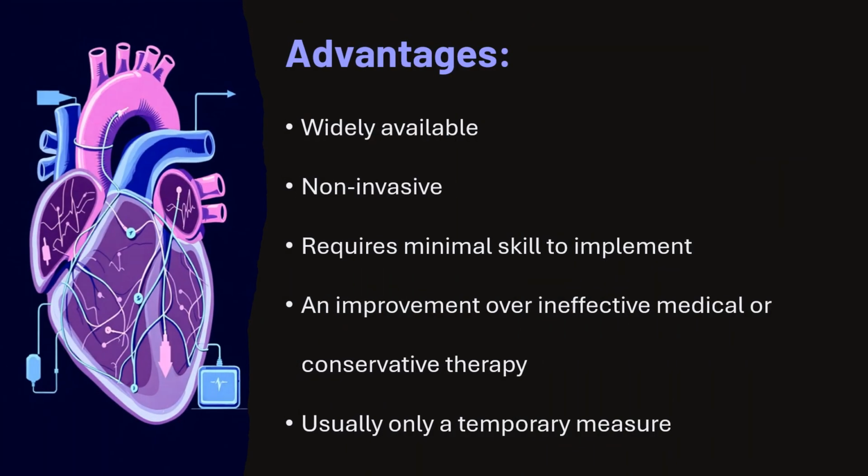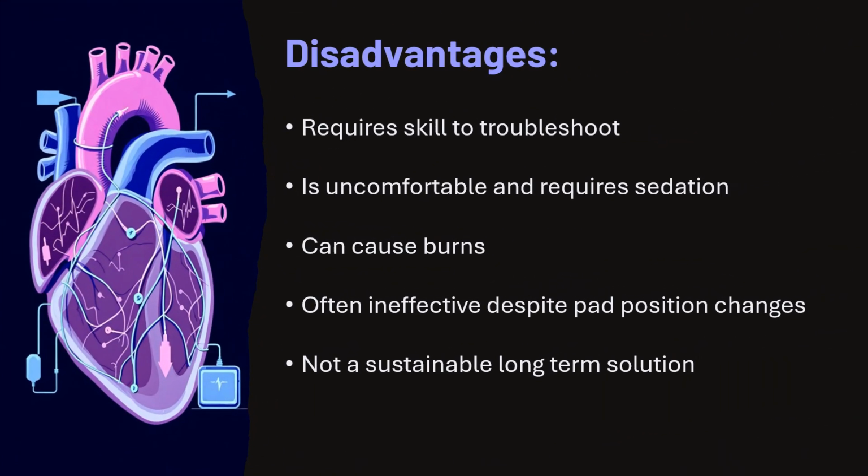The advantages of the transcutaneous pacemaker: it is widely available, non-invasive, requires minimal skill to implement, an improvement over ineffective medical or conservative therapy, usually only a temporary measure. The disadvantages: it requires skill to troubleshoot.